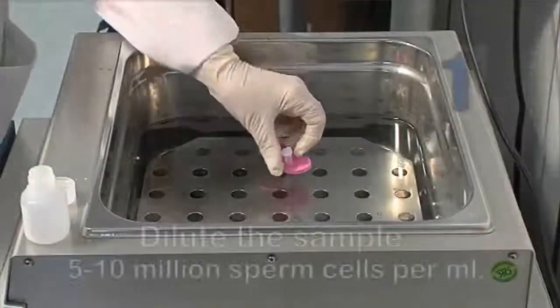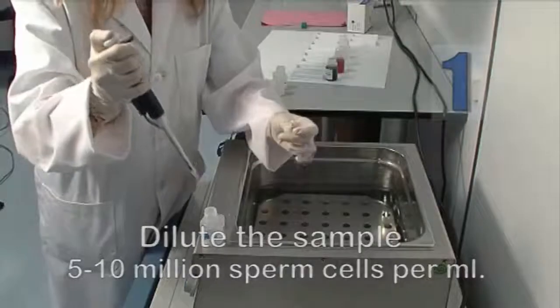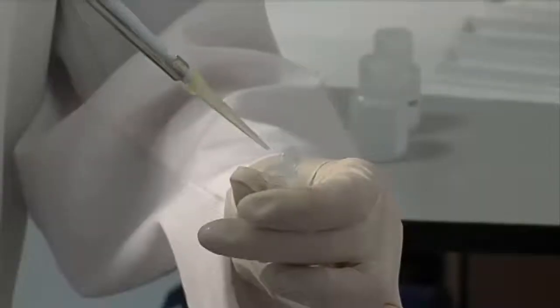Dilute the semen sample between 5 and 10 million sperm cells per milliliter in PBS or diluting agent with low protein content.